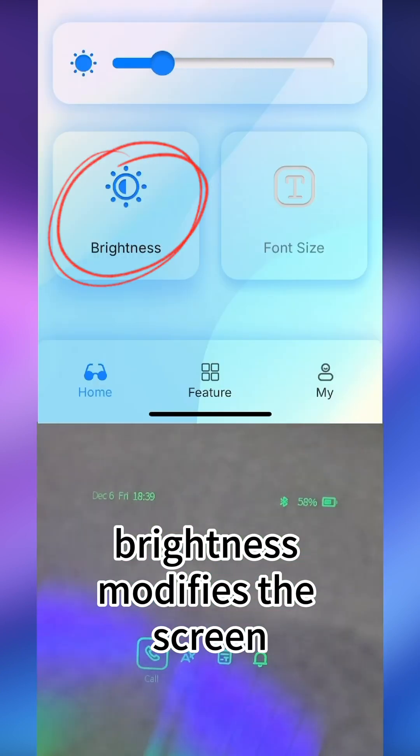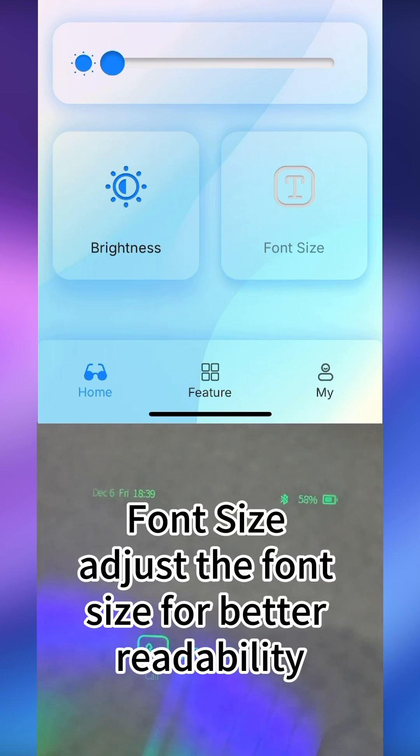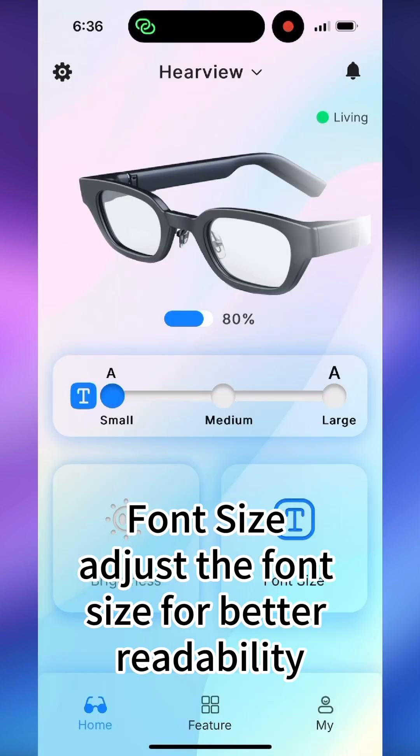Brightness modifies the screen brightness to suit user preferences. Font size adjusts the font size for better readability.